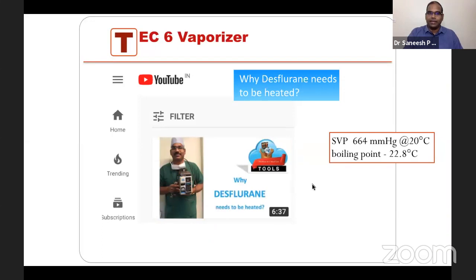Okay. There is a famous question. Why does desflurane need to be heated? I think I had put a YouTube video on that because that was an interesting fact. All other agents have a much lower saturated vapor pressure, around 240s, 280s and all, but we are not heating those. When it comes to desflurane, we need to give heat. So can somebody quickly tell me the logic?